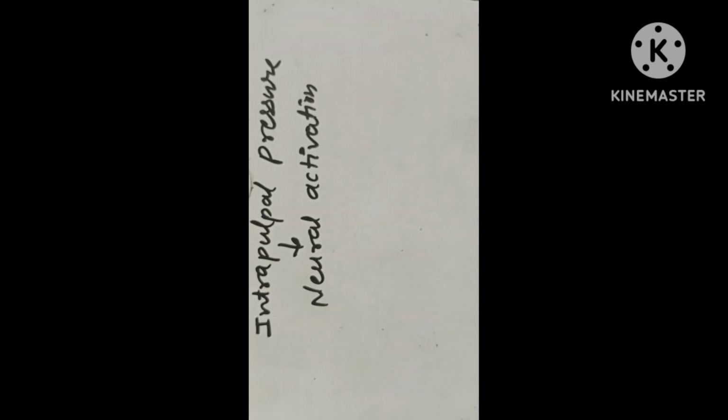When we apply heat, intrapulpal pressure will increase, and the intrapulpal pressure will activate neural activation, and neural activation causes a response on the tooth. Now we can see how we differentiate healthy pulp, irreversible pulpitis or reversible pulpitis by the heat test.